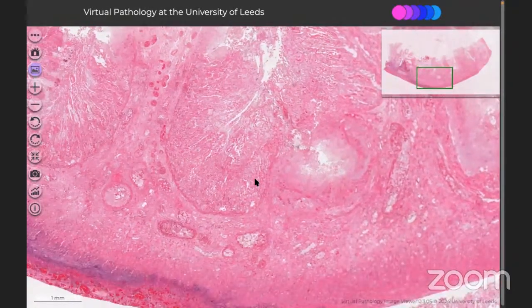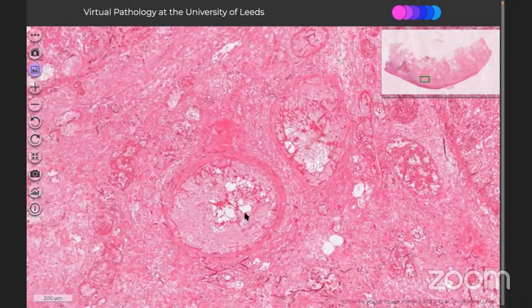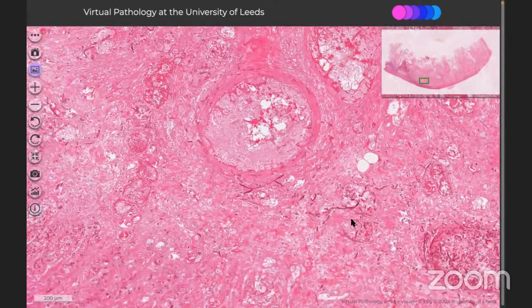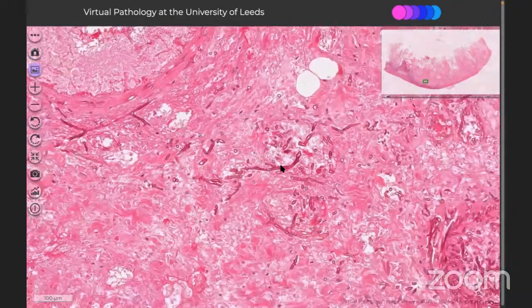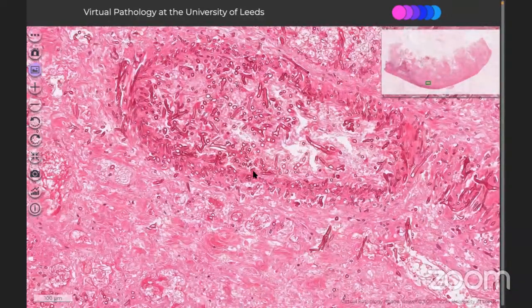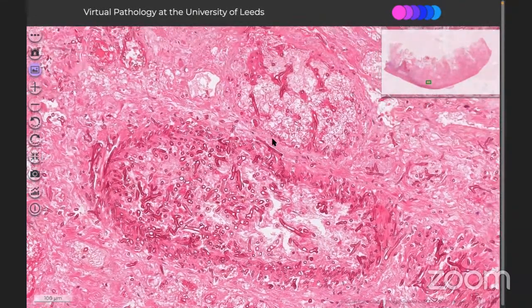And the thing is that the vessels are dilated. And if you zoom in and go on to the higher magnification, you can see this fungal organism, which has non-septate and broad ribbon-like hyphae. So they are infiltrating the vascular space. So this is quite characteristic for angio invasion. And so this is a ribbon-like hyphae, which is characteristic for mucor.